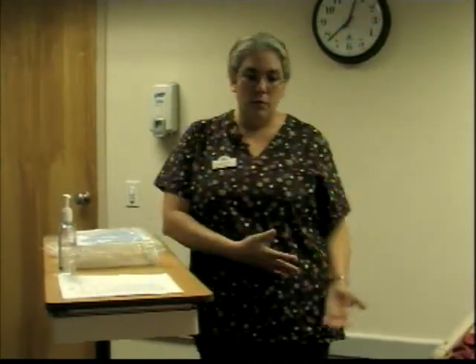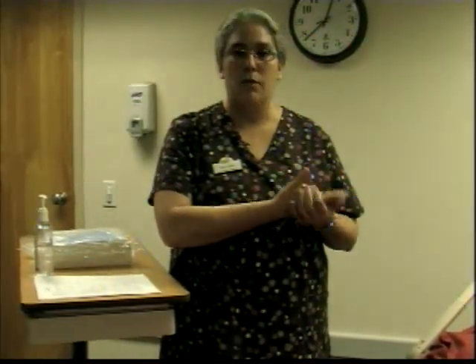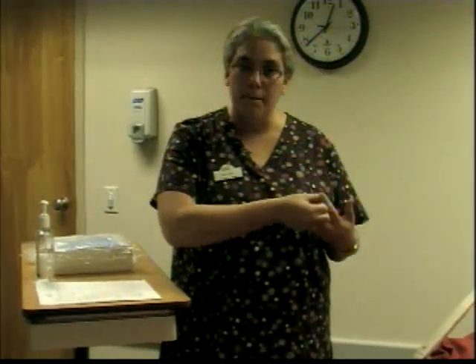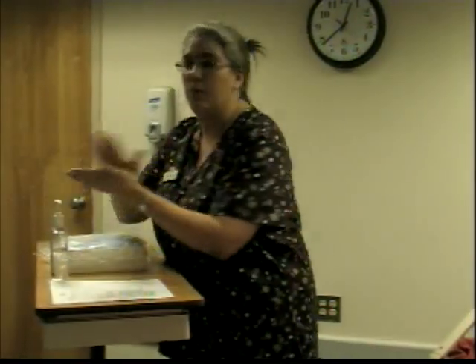As I'm coming into the room and doing all those things already mentioned — because of her history of stroke — I'm going to request my CNA to come in and help me with this procedure. Mrs. Faye is here to assist us. You come into the patient's room, wash your hands, and now we're going to position the client.